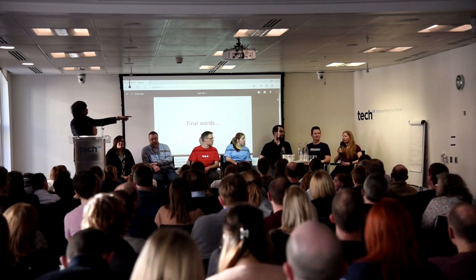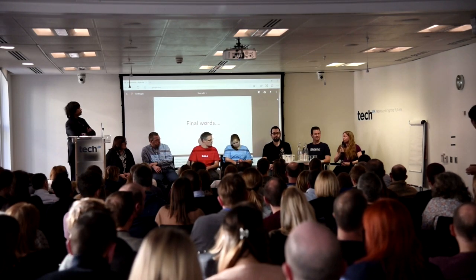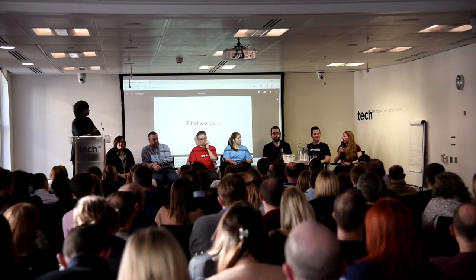Okay, got a question there? Yeah. Sorry. I vary my targets based on what I'm doing. So I'm normally between 4.5 and 5, but when I'm driving, I raise that temporarily up to 5.5. So temp targets are brilliant for allowing adjustment. But also I will quite happily see a prediction line go down to 3.5 because I know it will come straight back up again because there's less insulin in my system. It's not a hypo for me now, not what a hypo was before. Okay.